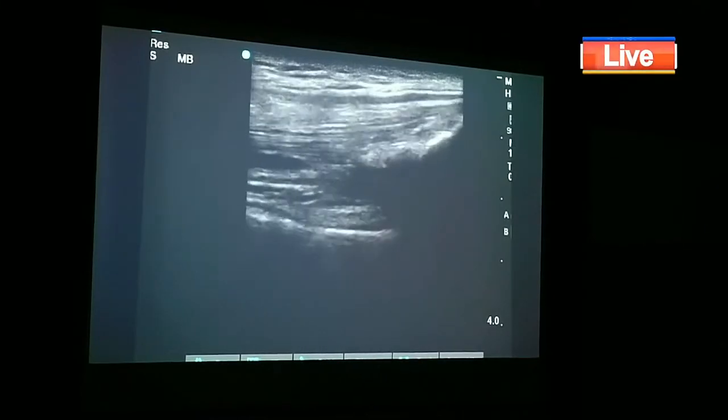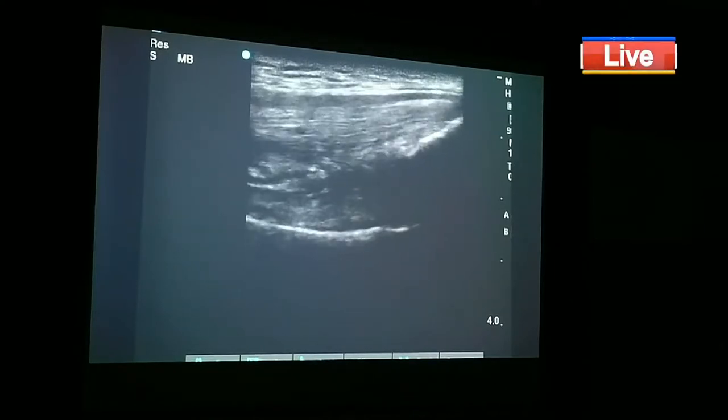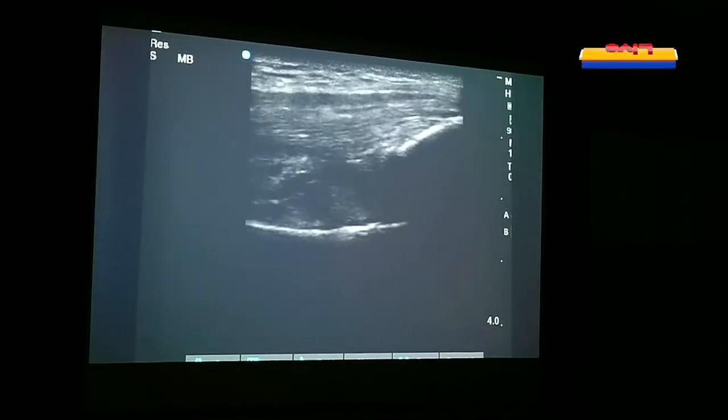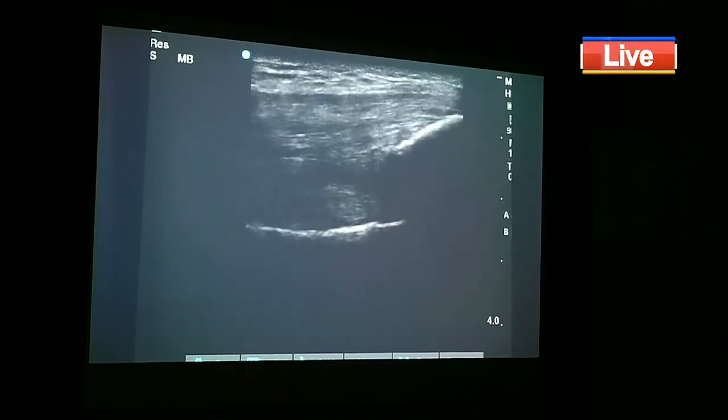If there is a very big effusion, you can put a wide bore needle and take all of it out if you want. But before that, look, putting a needle in the knee joint is extremely easy. The difficult part is preventing infections, preventing complications. So I repeat, do not do this in a non-sterile setting. This is the biggest problem. Non-sterile means even the air should be clean.